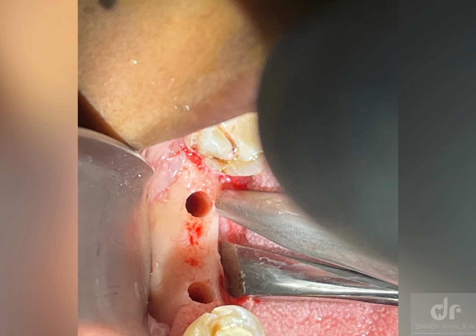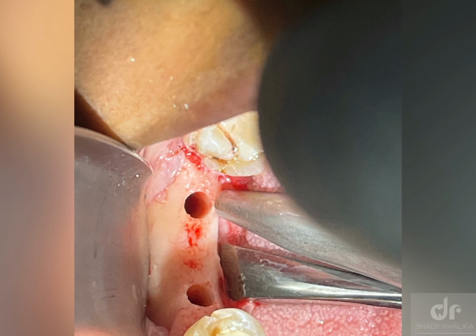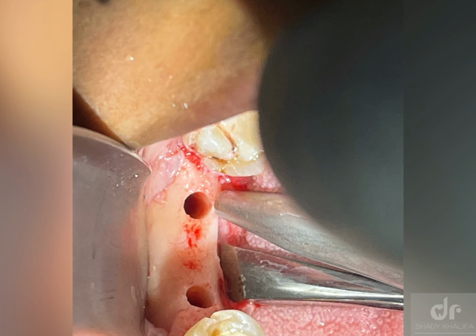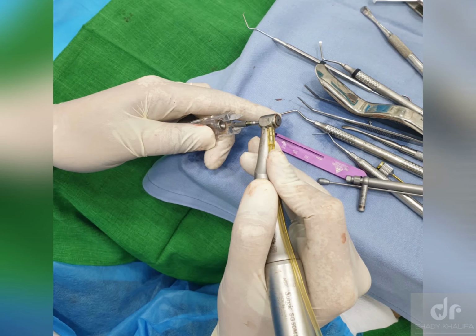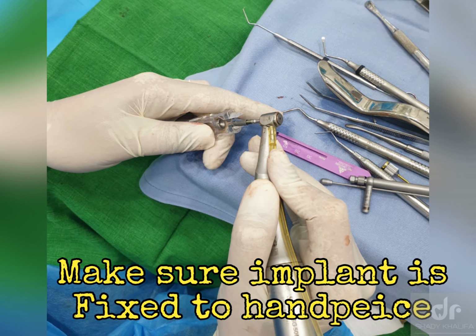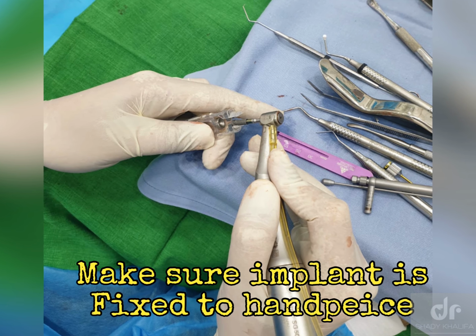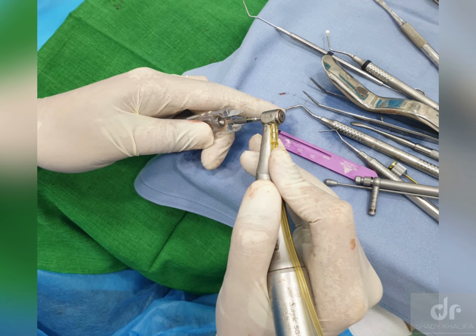If I take it from the other side, the mesial drill will not be shown well. So I think this is the best shot I take from here. Sometimes in other shots, I feel that it's very far from me.